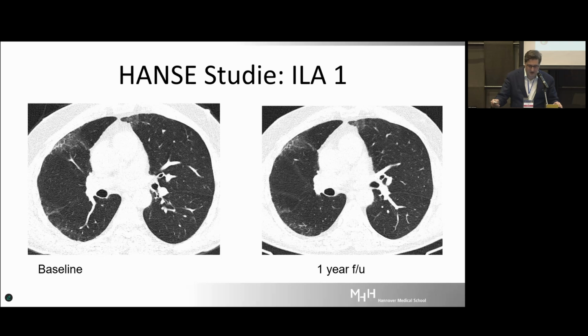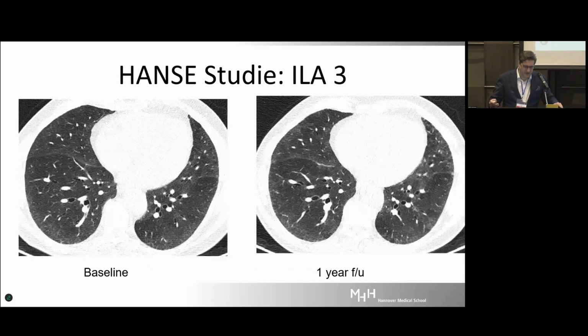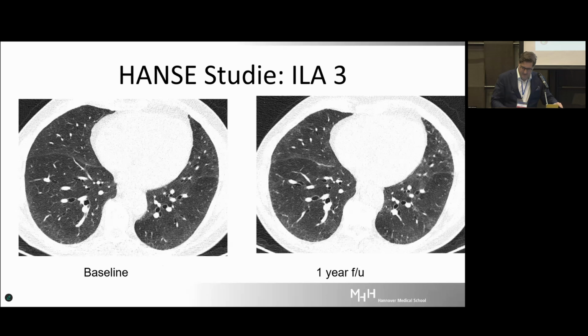You see that, and we call it, and we say go to your interstitial lung disease outpatient clinic, which we have here. And here, look at, I can't show, unfortunately. Oh, here. Yeah, look at that dilated airway here, right? We didn't call this. We thought it was dependent atelectasis, but look at the bronchiectasis here occurring. So this is clearly traction bronchiectasis from beginning fibrosis, and that was also sent. And here, a more subtle case where you see ground glass appearing, which is much more than before.